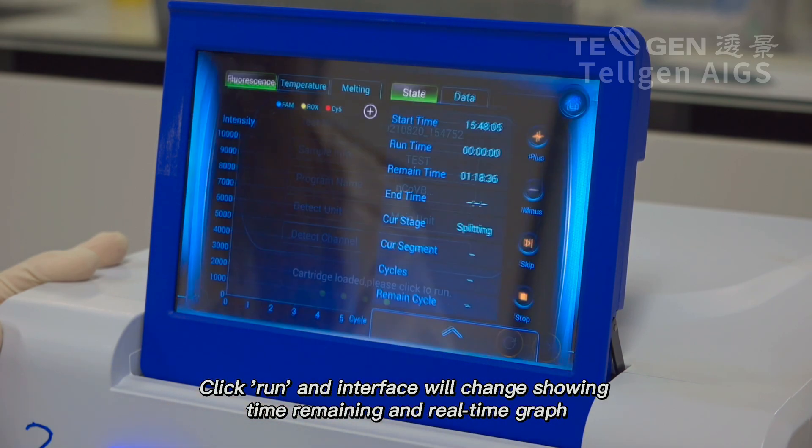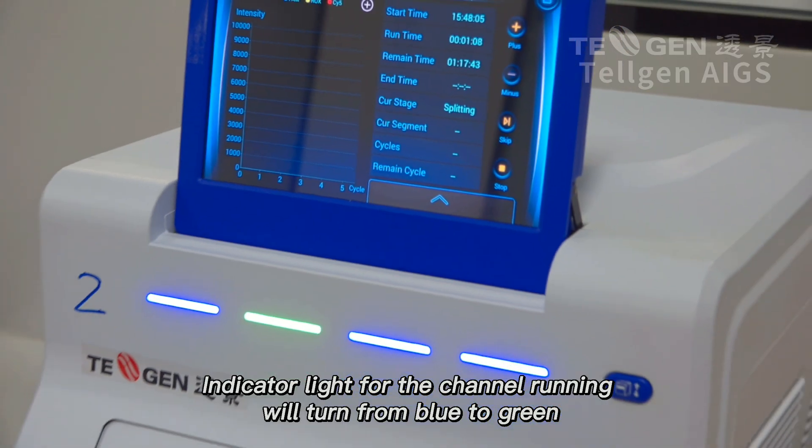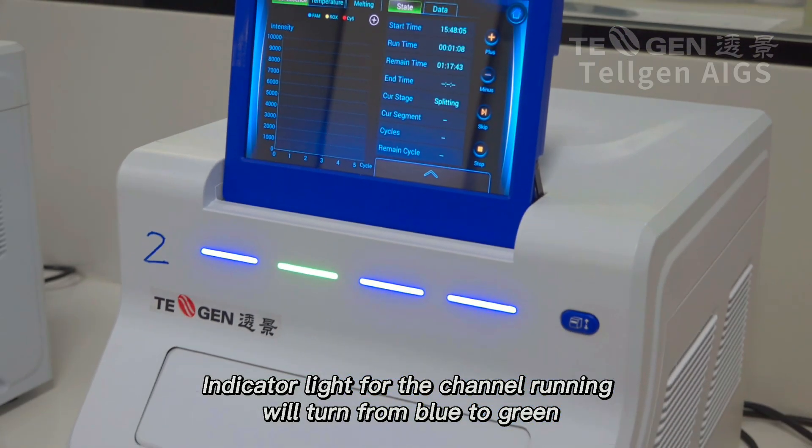Click Run. The interface will change showing time remaining and a real-time graph. The indicator light for the channel running will turn from blue to green.